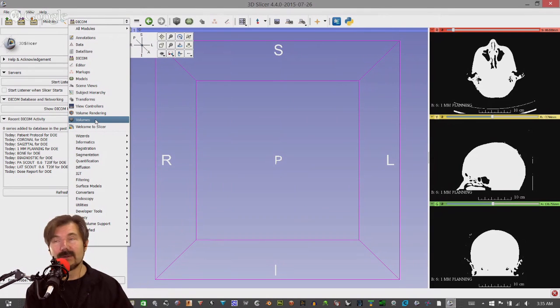The post-processing is just getting better and better on all of these systems. And I mentioned to Dr. Cleos that one of the things I read is they're actually using NVIDIA GPUs in a render farm to do this. So it's funny, the same thing that's generating the games you're playing shoot 'em ups with is also providing the GPU power for some of this fancy 3D rendering for medical imaging.